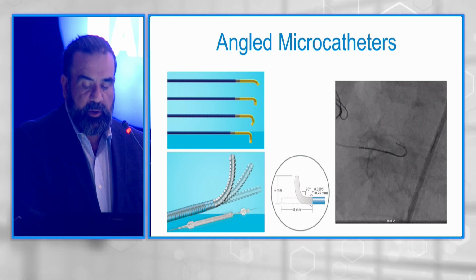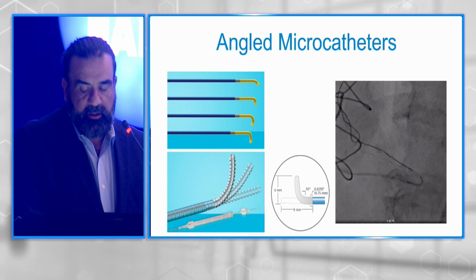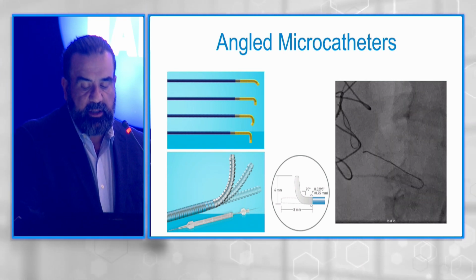What's really nice about the Supercross catheter is once you have enough wire purchase, you can actually advance the catheter over it, as you can see there, and change out for a stiffer wire.